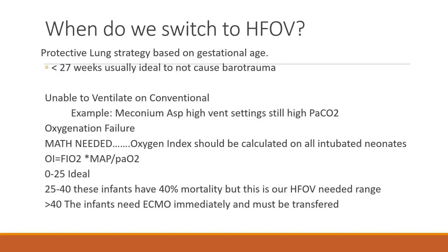So if they're younger than 27 weeks, obviously needing some respiratory support, needed to be intubated in the delivery room, we're going to know that those lungs are not fully cooked. So therefore, they're going to need to be ventilated, and it's much kinder to the lungs that are going to be really poppable, really easy to destroy, for us to go ahead and start on the oscillator, because the way the oscillator works with only ventilating at a mean airway pressure, and avoiding that open-close that causes a lot of barotrauma, that causes those shearing pressures that can really injure the lungs.